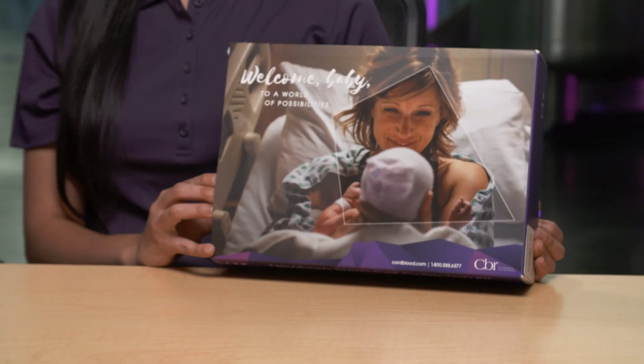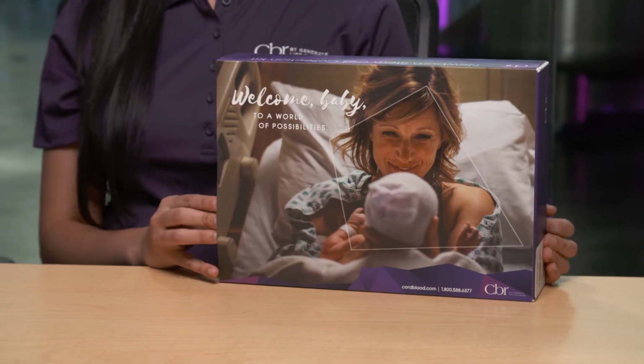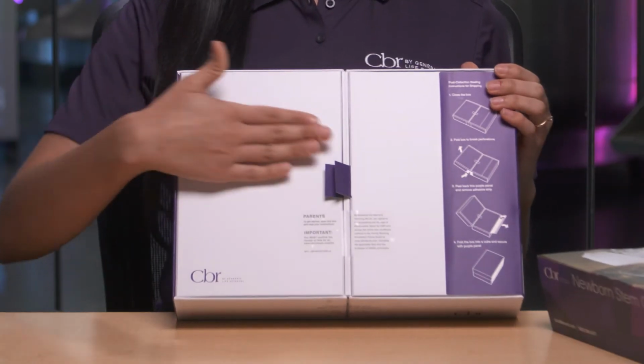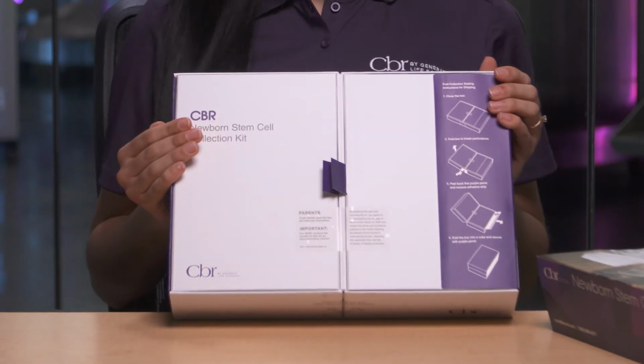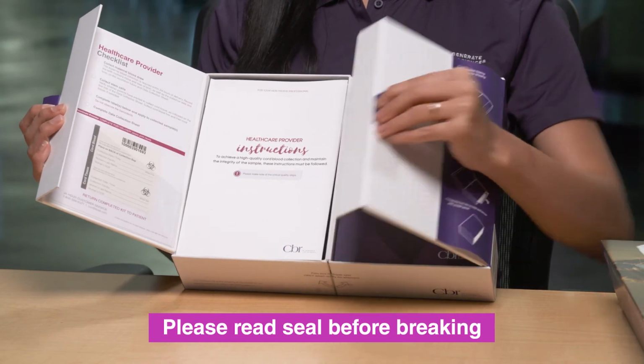Now, this is the exciting part. Let's open up your collection kit. It's very important that you get very familiar with all of the contents in it, but don't worry, you're not going to hurt anything. First, slide the sleeve right off the kit. You'll see two seals. Feel free to break them open. As you can see, there are two doors. Just break the seal between them, and that's it.